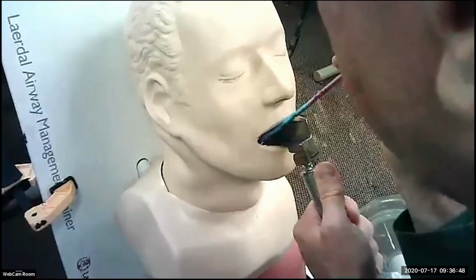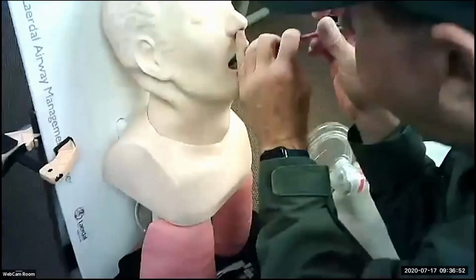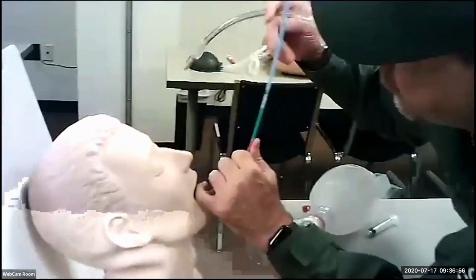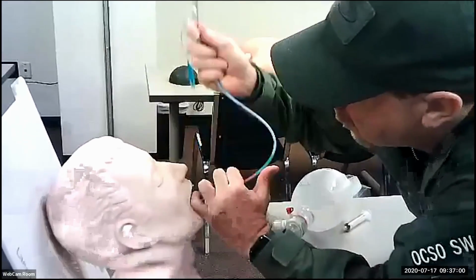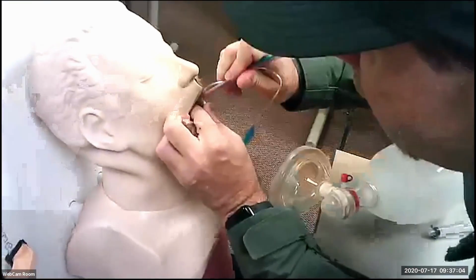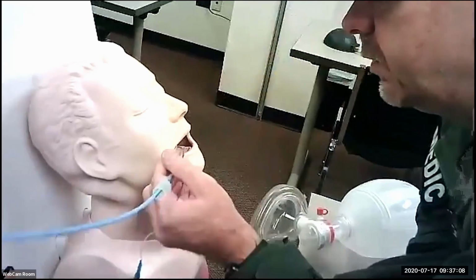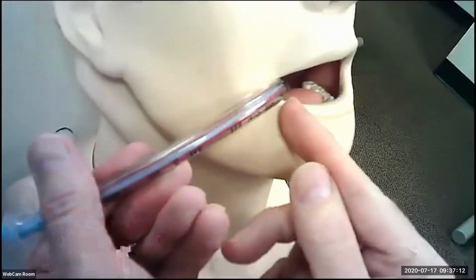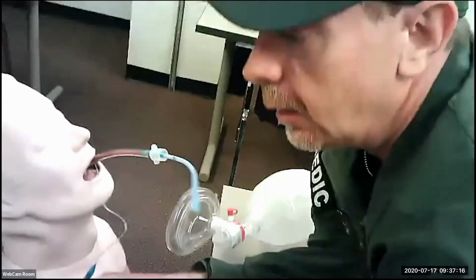All right, I can feel the tracheal rings. Once I get that through, I'm going to take the endotracheal tube, breathing tube, and I'm going to slide this over it. All right, pass it all the way down. PA students, all right, 21 to 22 centimeters at the lips. These have got numbers on there. That is about as deep as you want to go. That way you get in the right place.